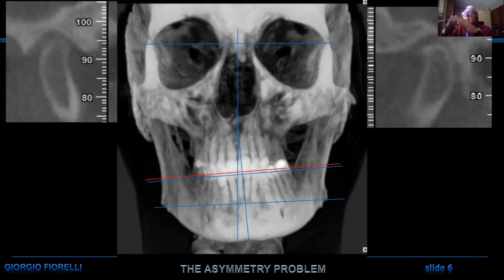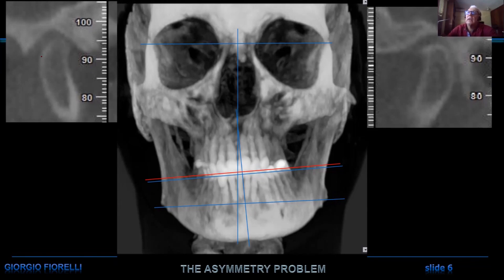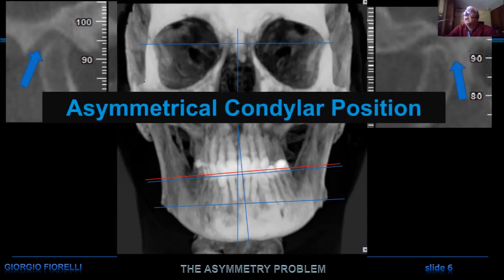Nowadays, we never have a significant asymmetry without me asking for a CBCT. The only real thing I can add from the CBCT to my clinical observation is the position of the condyle. Looking at this, we can see that the two condyles have an asymmetrical position — there is a much larger distance in the two posterior areas. This is important information for my future treatment.